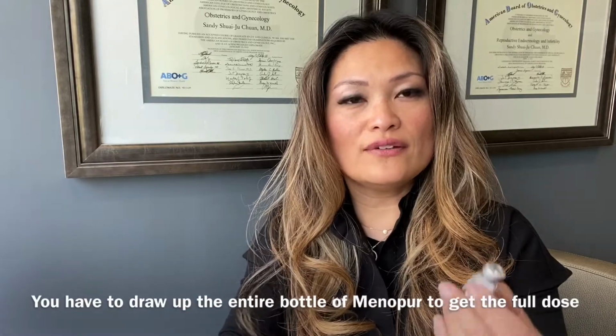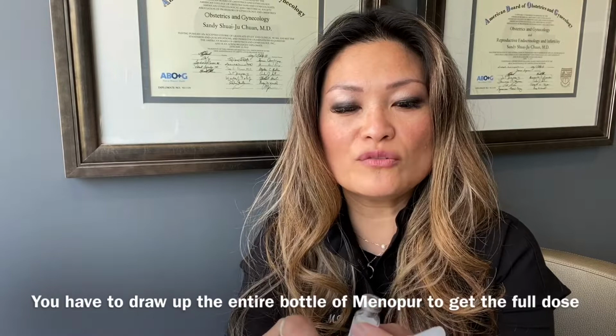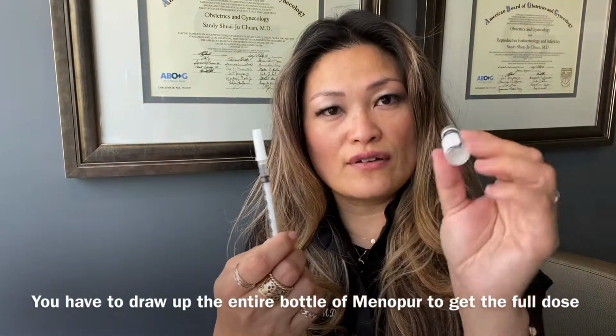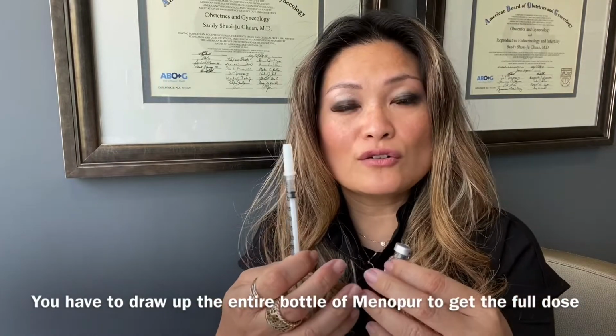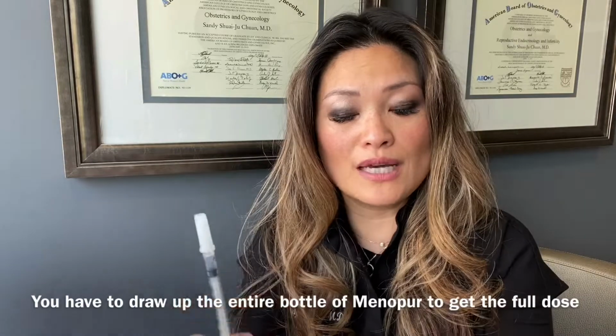I unfortunately have had patients use this needle to draw up the Menopur and go, oh, I'm giving myself 75 units. And they give themselves this amount, and then they have a whole bottle still left here. That means that they're only getting a tiny part of the 75 units they actually need. So that would not be ideal. So please remember to only use this needle for your Gonal-F, okay? So that's really, really important. So we can open that, set that aside, and then I'm going to teach you how to mix your Gonal-F.